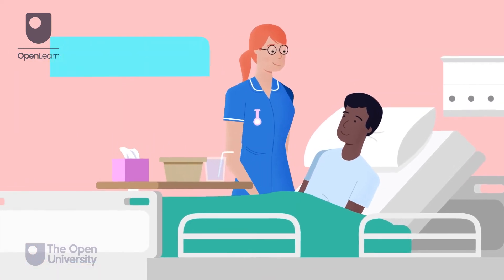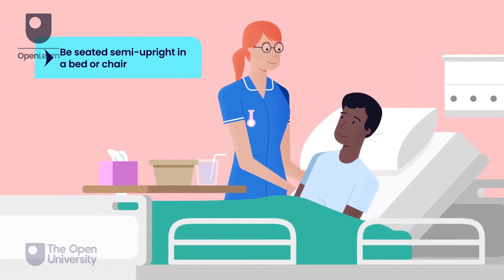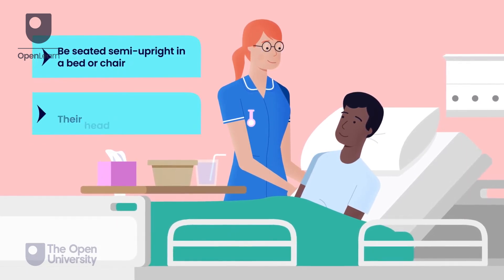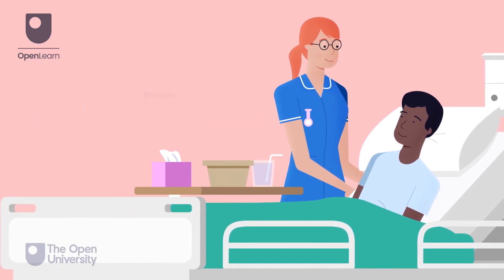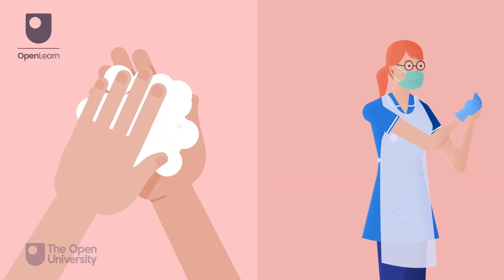The person should be seated semi-upright in a bed or chair. Their head should be supported with pillows. The emesis bowl and tissues should be within reach. Perform hand hygiene and don relevant PPE.